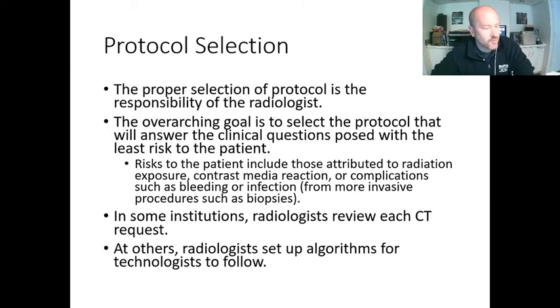So changing gears just a little bit now, we're going to talk about chapter 11 in the textbook and how they've got some general outlines of how to select protocols for patient care in CT. So this is ultimately the responsibility of the radiologist. So we're working in a team with the radiologist, and we're going to need to communicate with them really closely. That may be different from some of the other expectations that you've had. Like if you're in radiation therapy, you'd be like, what? Work with the radiologist? I've never worked with the radiologist.